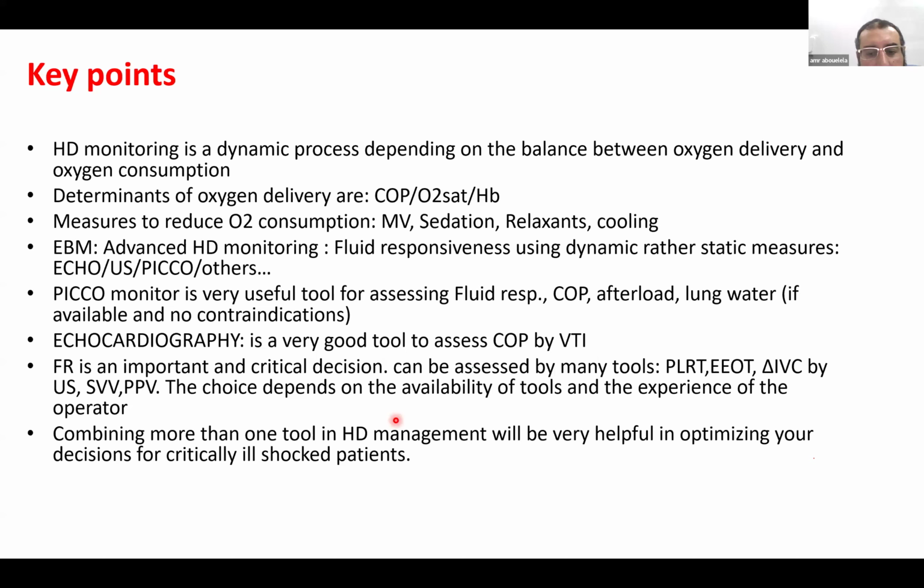The choice depends on the availability of tools and the experience of the operator. You should make your decision according to the available tools, but still, if you don't have tools, as I told you, a test like the passive leg raising test in the presence of a capnogram is not something difficult to have in any basic ICU. Combining more than one tool in hemodynamic management will be very helpful in optimizing your decision for the critically ill shocked patient. I finish at this point.